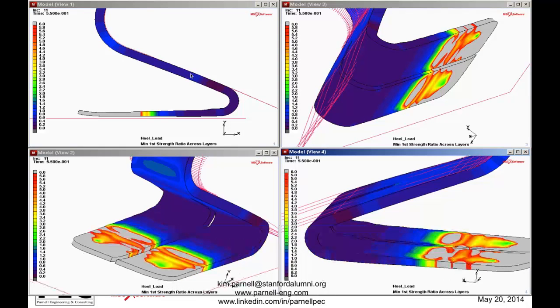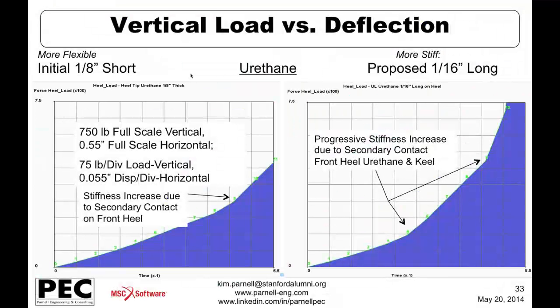And then stepping through there. So this is that longer urethane pad where you get a more progressive contact as you go through. And here's a plot to compare vertical load versus deflection. So essentially the slope here is an effective stiffness of that heel component in the way that we're loading it here at each time.